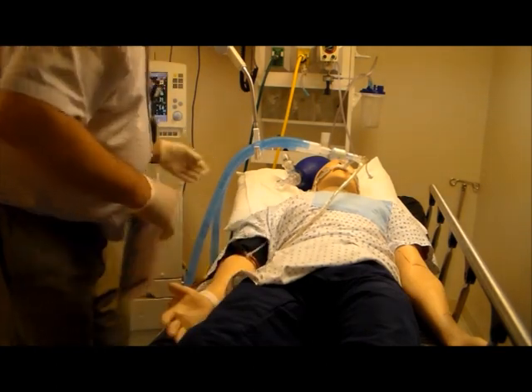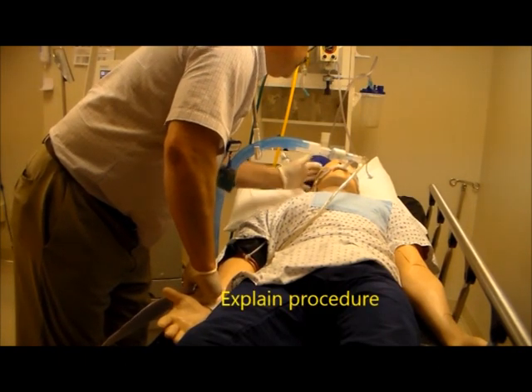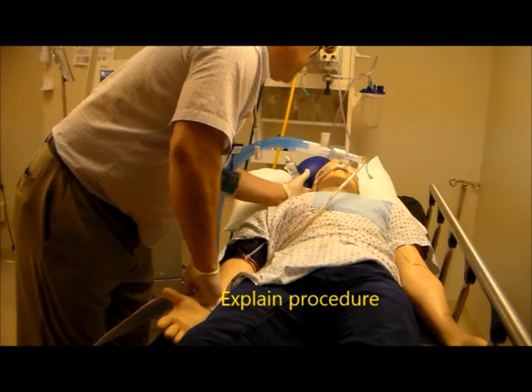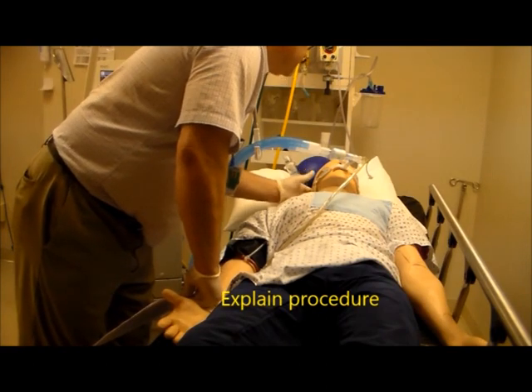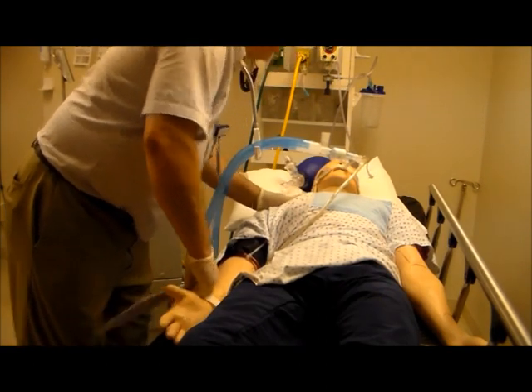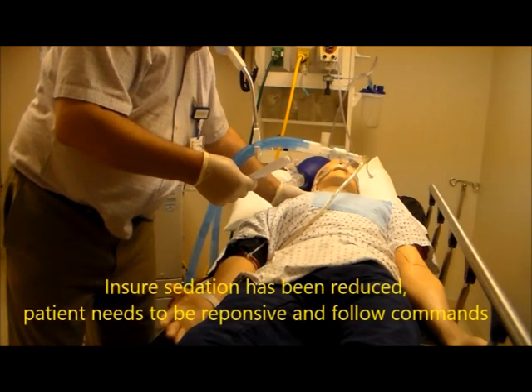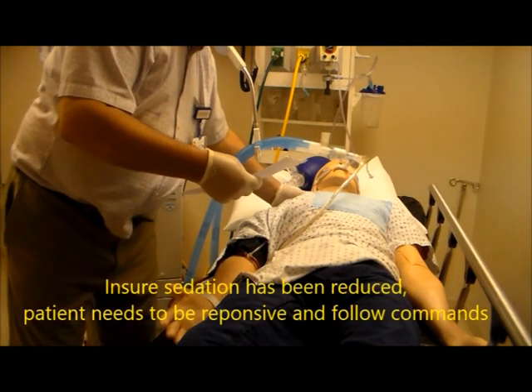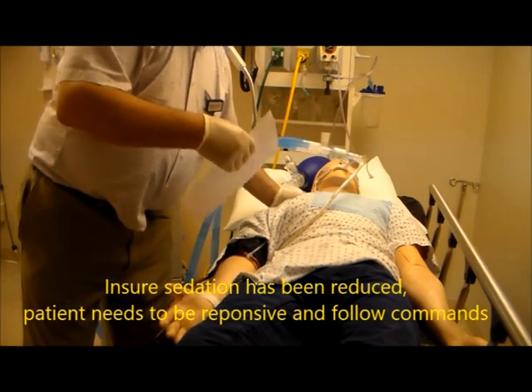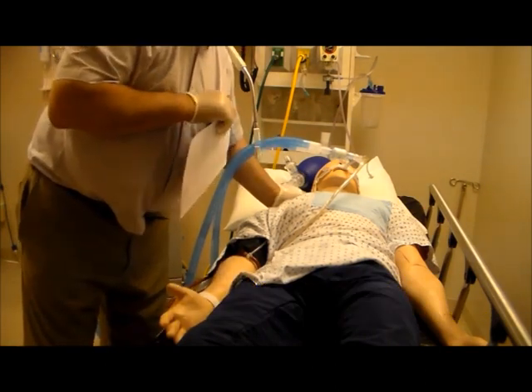Good morning Mr. Smith. How are you doing today? We're going to be doing some measurements through the ventilator to see if we can get rid of this tube. Additionally, you want to make sure that the sedation is decreased, they're responsive, and do they follow commands? Nurse, have you decreased the sedation?